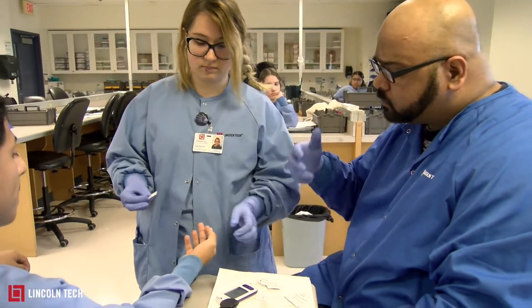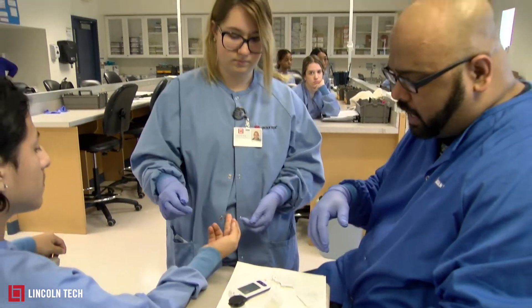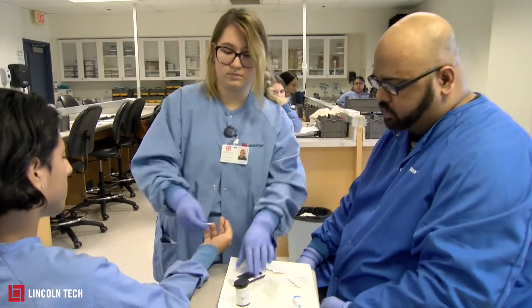First, you need to clean the area — just one swipe of the aqua pad — and put that aside. Then let it dry for about five seconds. After that, she's going to put the strip into the machine.